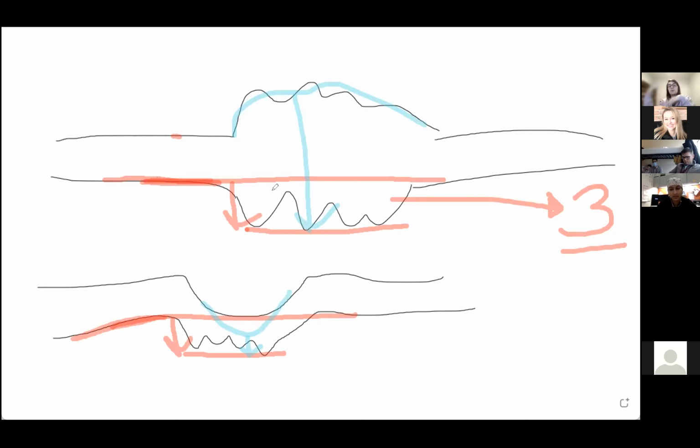If the tissue is fragmented and disoriented, it can be very hard to measure that depth of invasion. But once we have a nice resection specimen where we section it perpendicularly to the mucosa, we can look at these sections very cleanly and measure that depth of invasion. All right. So that's what I wanted to point out there. And so sometimes there's contention, or discussion about the true depth, because this can sometimes be a challenge to measure.